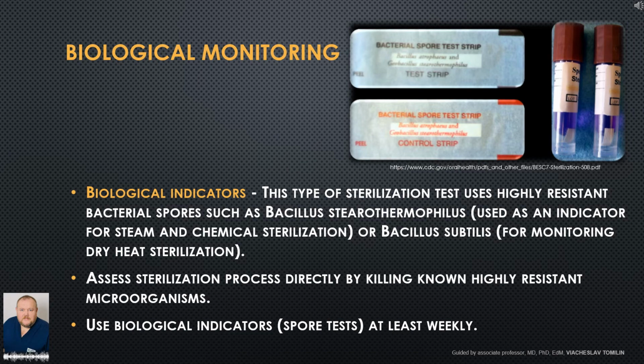These tests allow quick remediation and validate proper infection control procedures without a long lag time during which the sterilization procedure may have become ineffective but is not known. It is recommended that biological monitoring be conducted at least weekly and with every load that includes an implantable device.